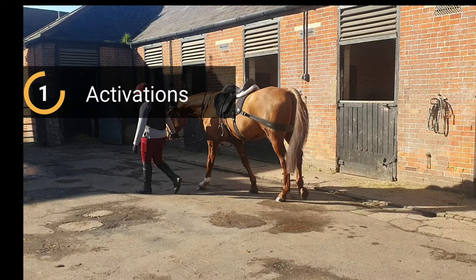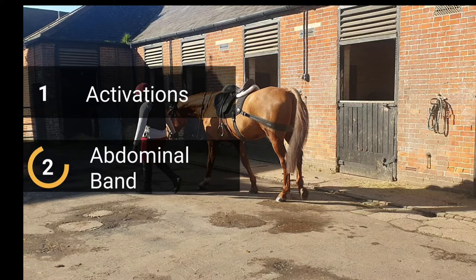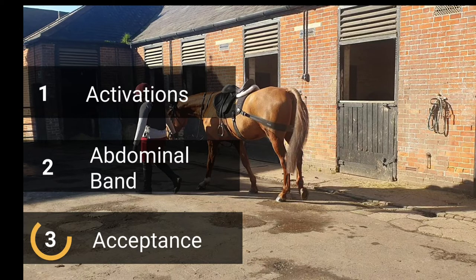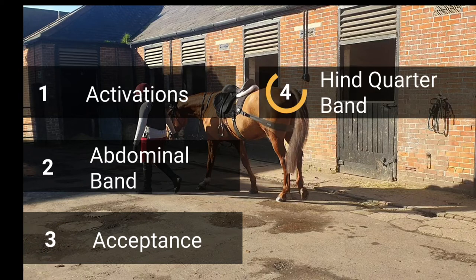Step 7. Make use of preparatory exercises to activate target muscle groups. Step 8. Introduce the abdominal band first. Check that the horse willingly accepts the bands. Step 9. Fit the hind band between point of buttock and stifle.